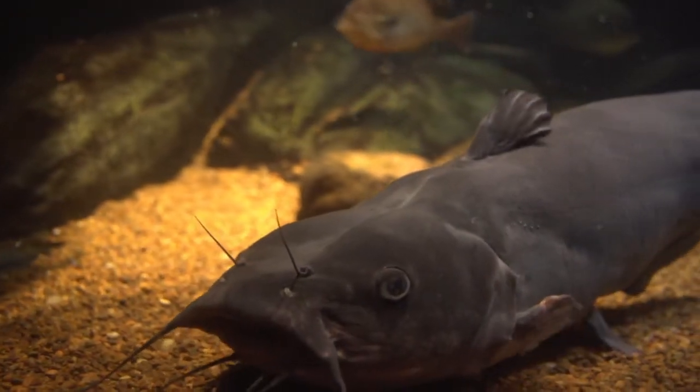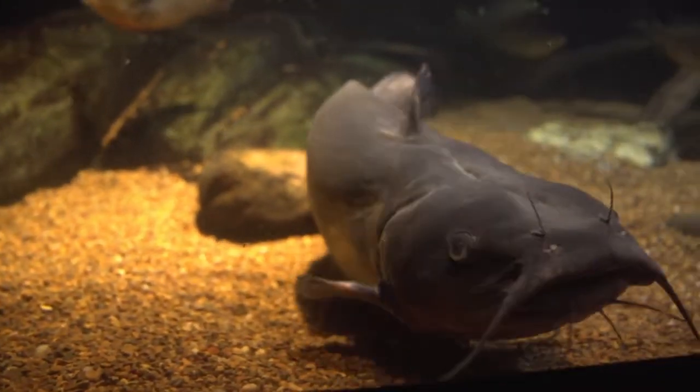My name is Erin Culpepper and I am the current veterinary intern at the National Aquarium. Today we are going to be performing a surgery on a channel catfish named Mrs. Bojangles.